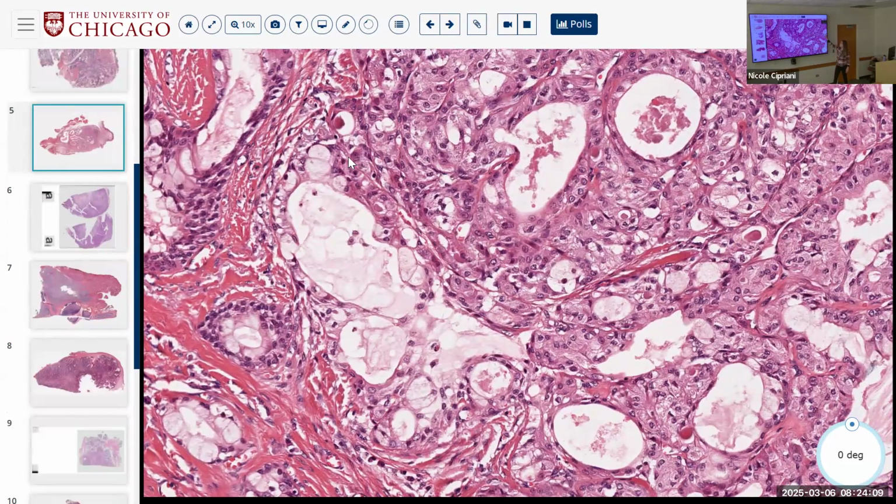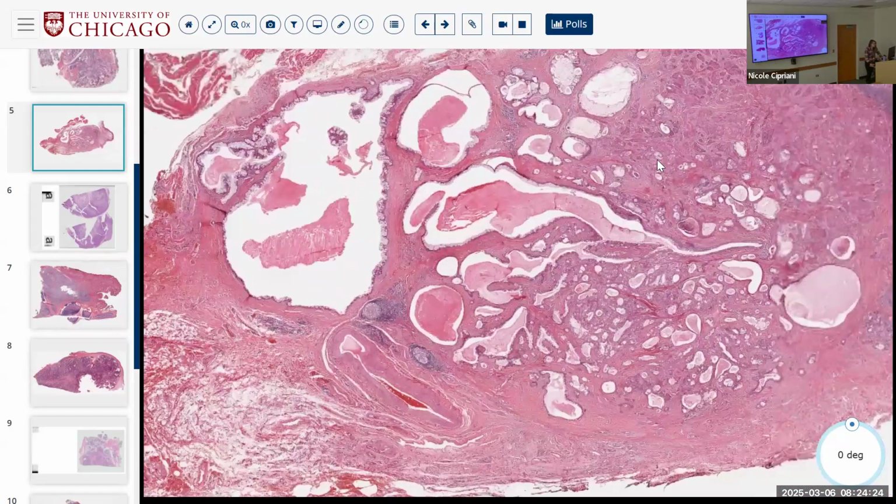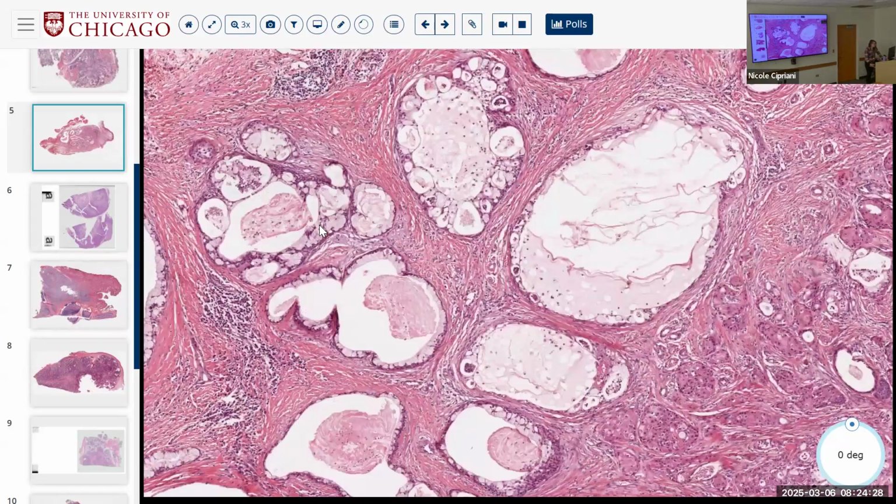So if you have diffuse, more than just peripheral expression of P63, P40, it could help support a mucoepidermoid carcinoma, because the predominance of cells are positive for that. What is the fusion of mucoep?